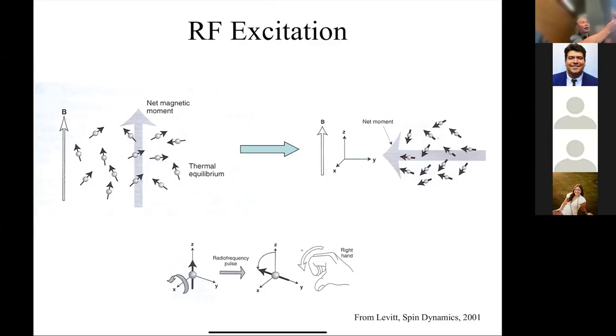If I just look at the changing magnetic field here, there's no changing magnetic field from this spinning around its own axis. I have a receiver here to detect a changing magnetic field, so I have to make this tip so that now this magnet is moving around like this. Therefore, it's going to create a changing magnetic field. Does everyone see why that makes sense?